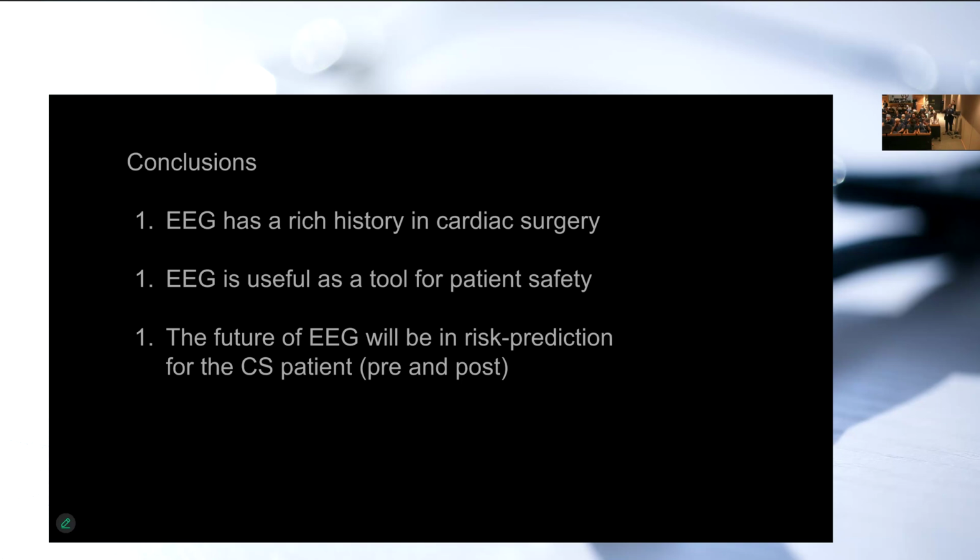I see burst suppression in the OR. Is it because the patient has less quote-unquote brain reserve in response to my standard anesthetic? Is that a predictive sign at all? Or is it just that maybe I give more than I intended to and I just caused burst suppression and I'm the cause of the issue, and that has no predictive value?